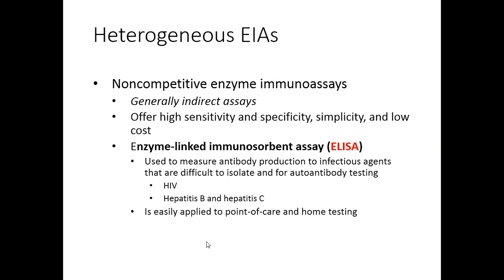And we're going to look specifically in a second at enzyme-linked immunosorbent assays, or ELISA testing. Honestly, ELISA testing and EIA are pretty much synonymous at this point. When people talk about ELISA, they might talk about EIA, and vice versa. It's really the most common EIA, so the terminology is becoming kind of blurred. The line is blurred, but they do mean different things. ELISA is very specific in that it is used to measure antibody production.